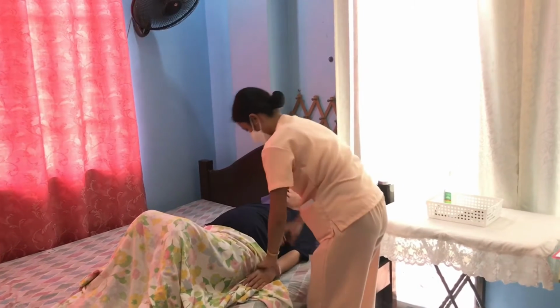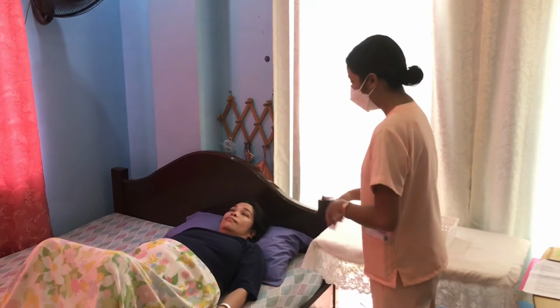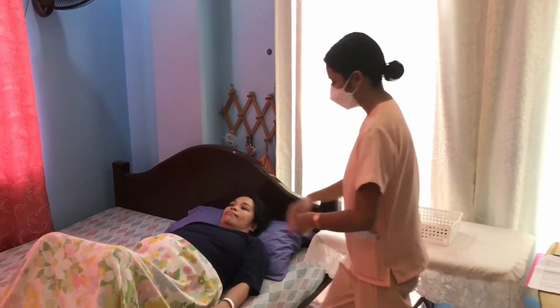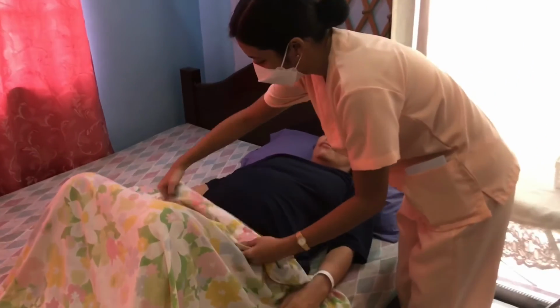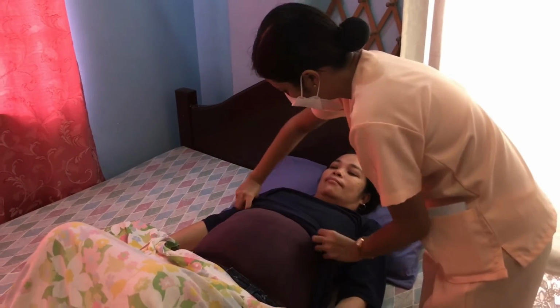Place her arms by her side. So now, ma'am, I'll be exposing your abdomen. Drape the client with a draw sheet. Expose her abdomen below the breast to the symphysis pubis.